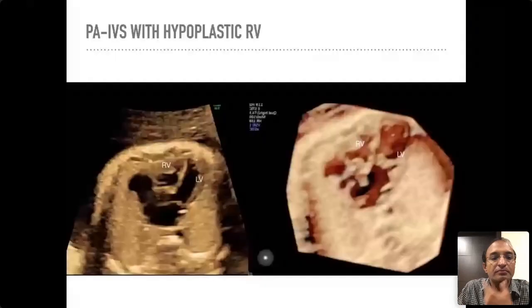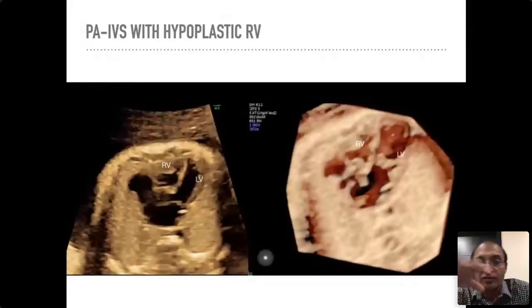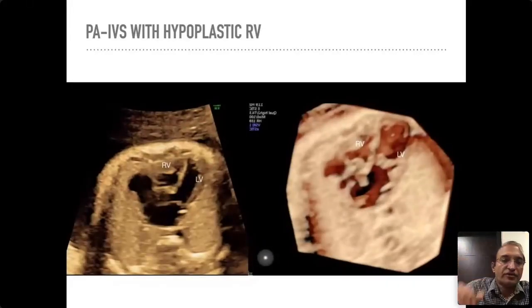So these are the three ways to differentiate Ebstein's from tricuspid valve dysplasia: the level of insertion of the tricuspid valve, the origin of the TR jet on color Doppler, and the size of the right ventricular cavity. There is one more method which we haven't discussed for the sake of simplicity.